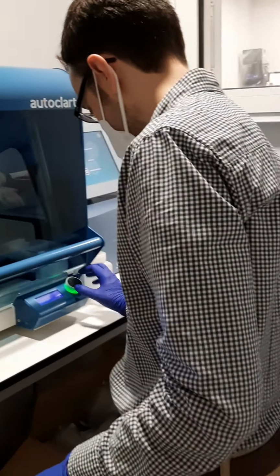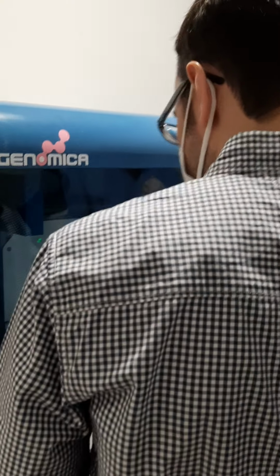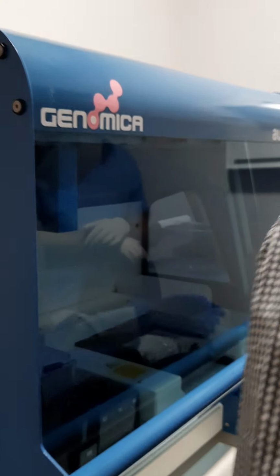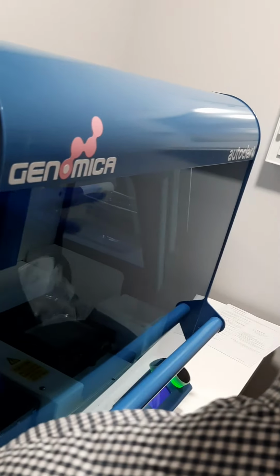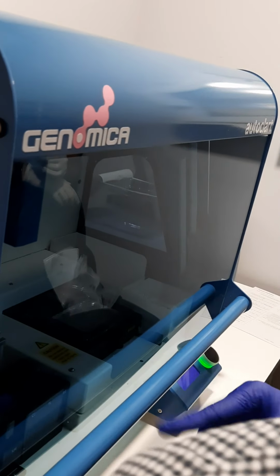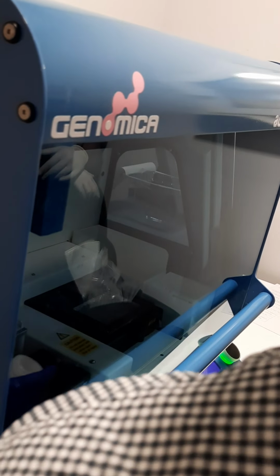There is also a cleaning menu with the use of reagents and so on. We have this additional bottle. In the cleaning menu, it's going to ask to fill this with bleach 10%. It's going to run bleach 10% through the system, and then it's going to ask us to place a bottle of water to wash again with water.